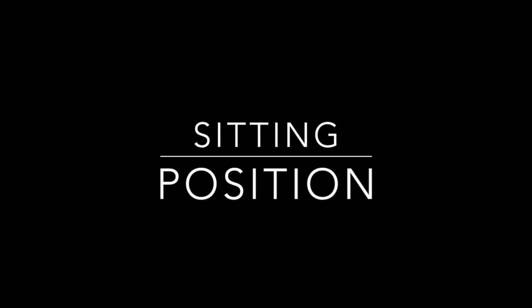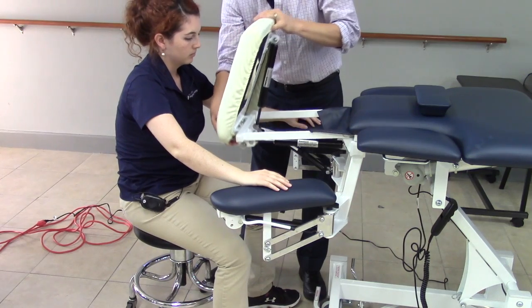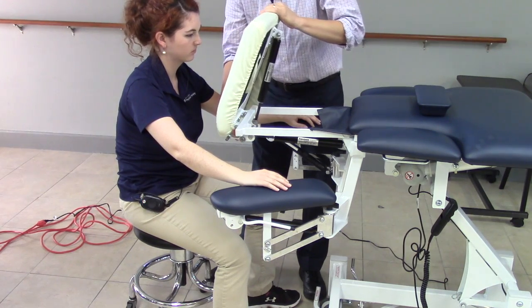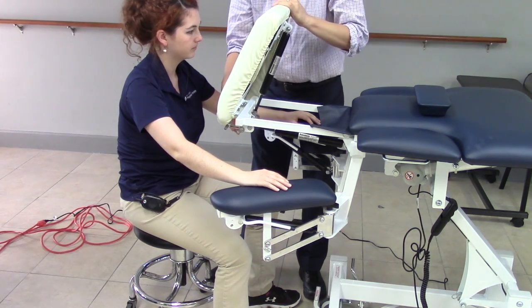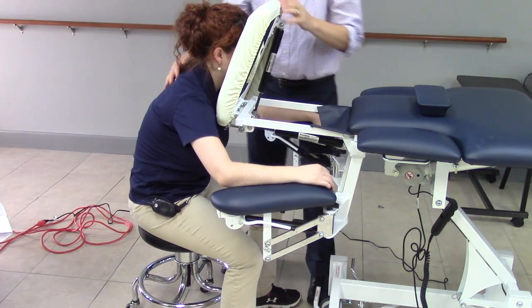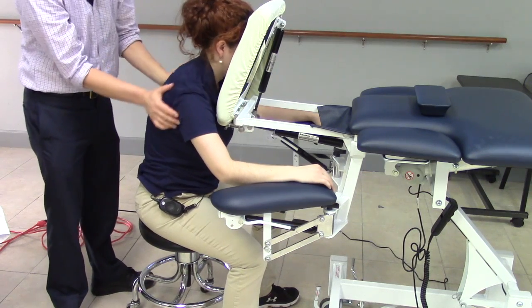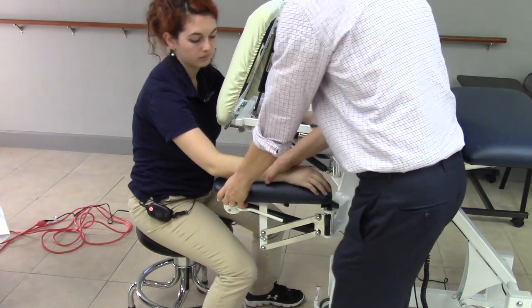You can also position your patient in the sitting position. The right lever moves the headpiece up and down; the left lever tilts the headpiece forward and back. Adjust the armrest comfortably, set the headrest tilt and raise to the desired level, and have the guest rest within the cervical and armrest region. You can then perform treatment on the lumbar area, cervical, shoulder, or any area you choose.